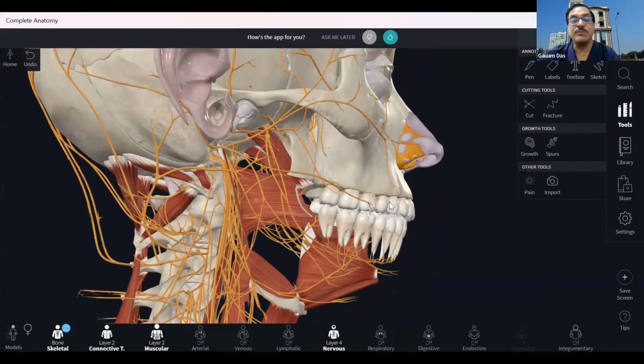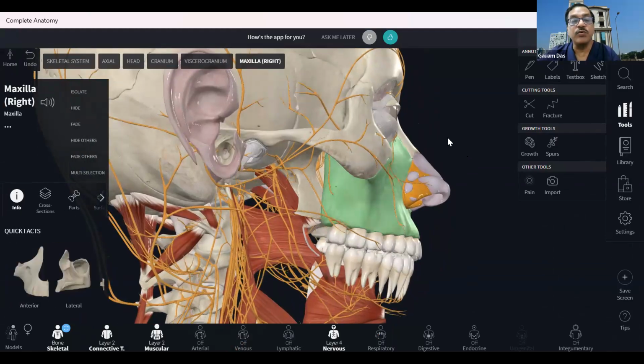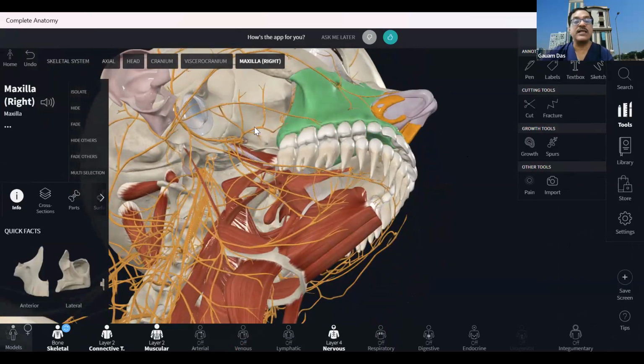Posterior to that is your mandibular. And if we are going into the foramen ovale, so this was your foramen ovale. Here you can go for it, but the standard technique is CT guided, for the sphenopalatine as well as the foramen ovale. Okay, is it clear?